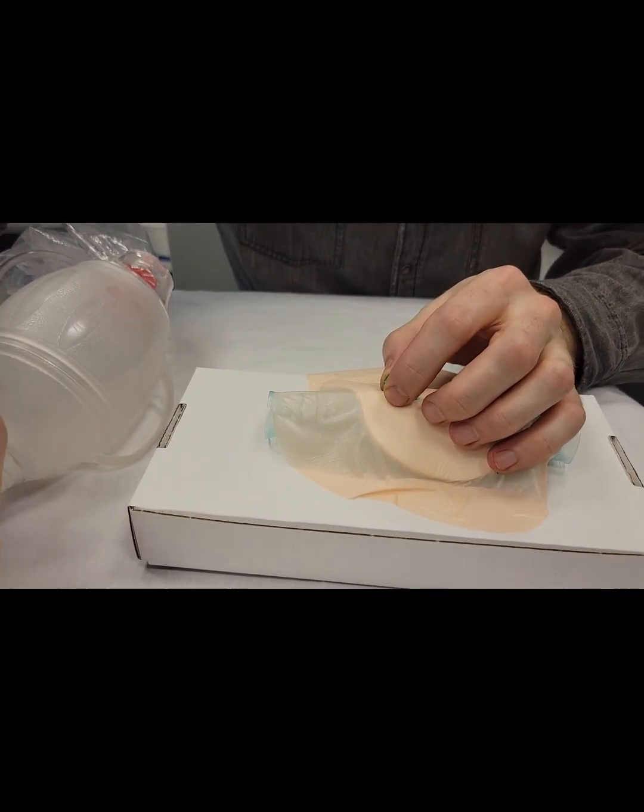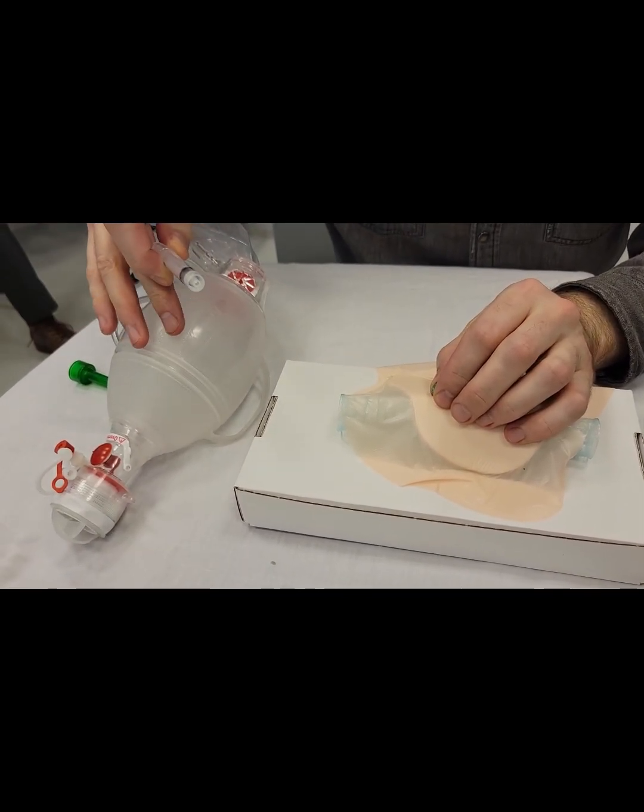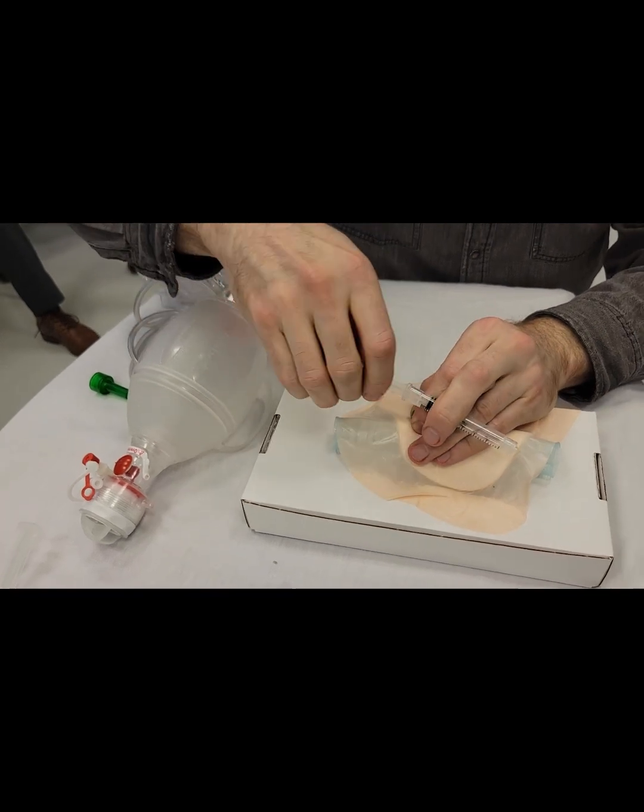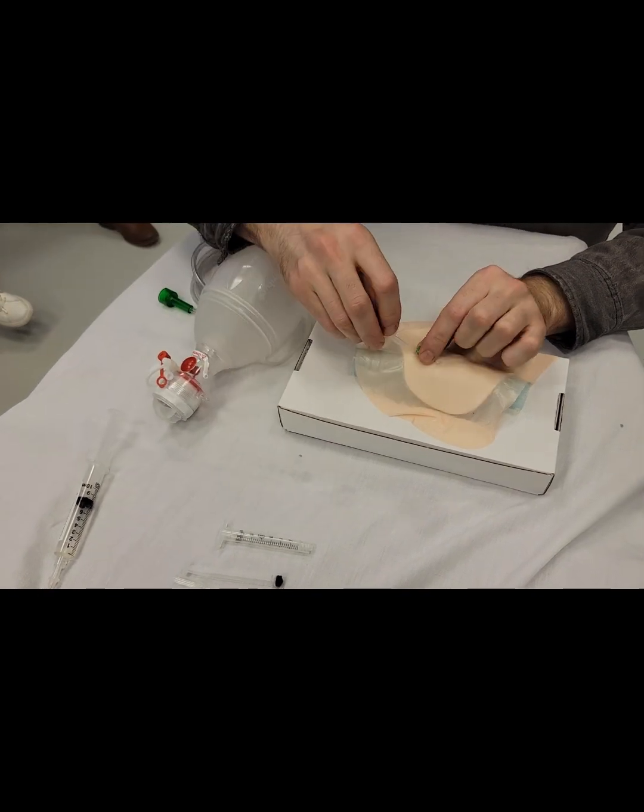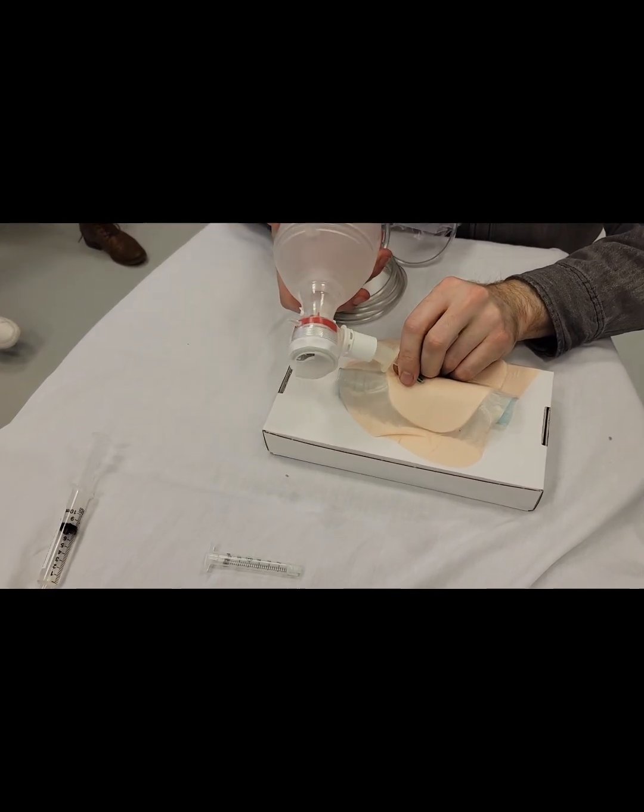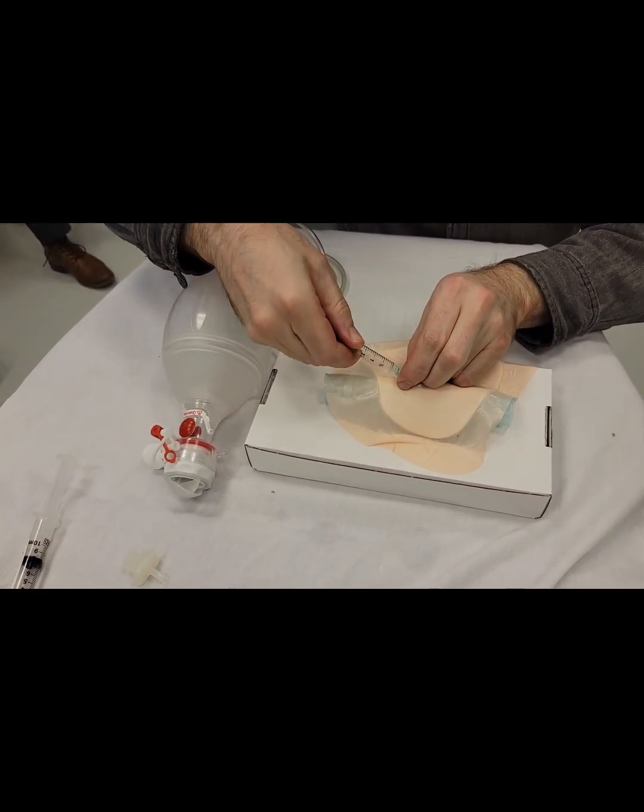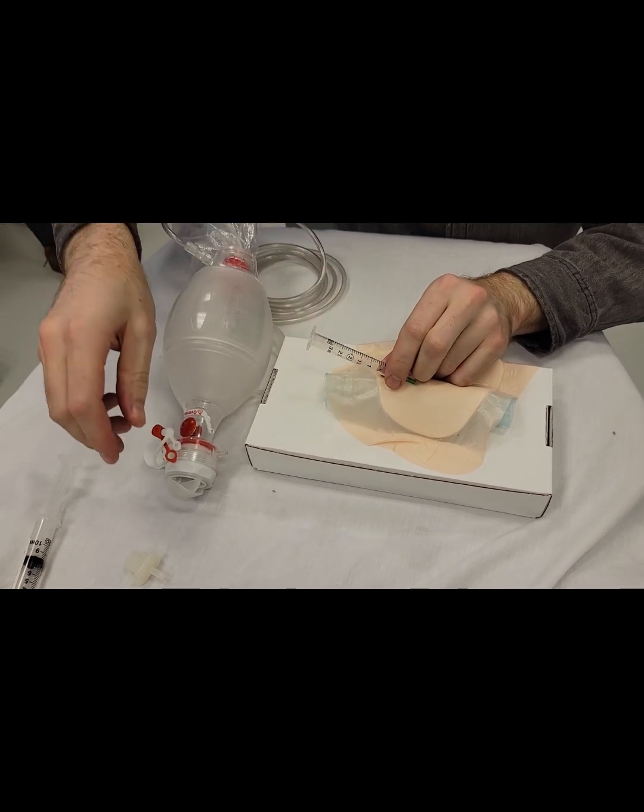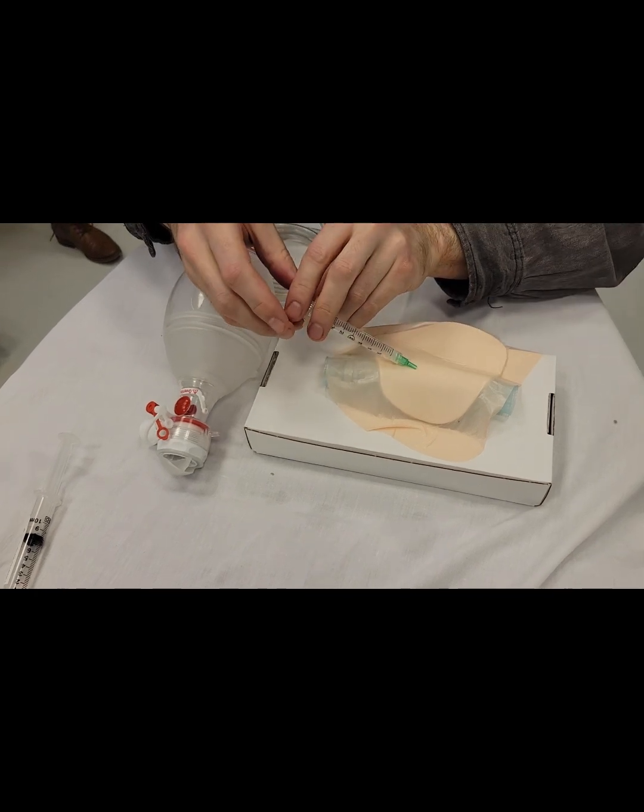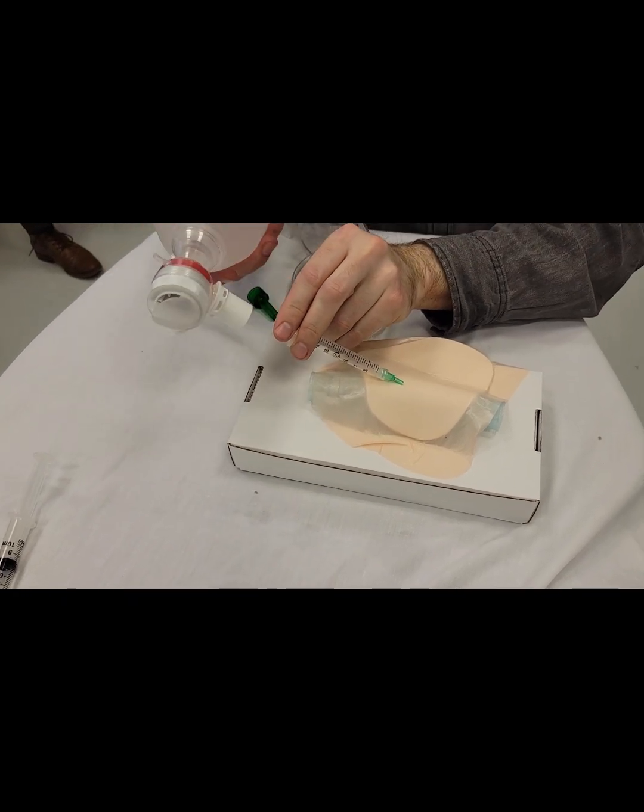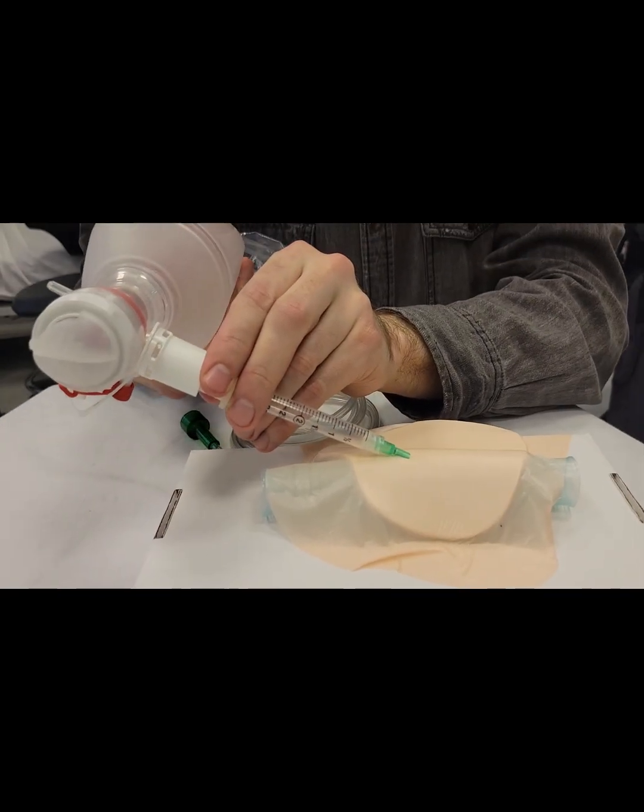At this point, you need to connect the angiocath to the BVM by way of either a 3.0 ET tube connector directly to the angiocath, and then from there to the BVM, or you can use the 3 millimeter syringe, and then you can take a 7.0 ET tube connector that fits into the 3 milliliter syringe and then connect to your Ambu bag, and then go ahead and ventilate from there.